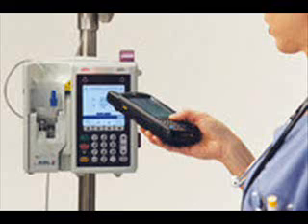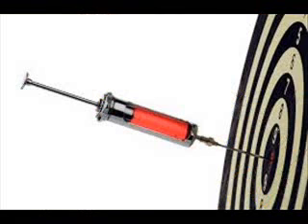Some common applications include pumping fluids in an infusion device, aggressive chemicals, and other materials where isolation of the product from the environment, and of the environment from the product, is critical. It is also used in heart-lung machines to circulate blood during bypass surgery, as the pump does not cause significant hemolysis. For this application and the importance of the infusion pump, it is relevant to mention the precision with which it must deliver the fluid, for the best control and to avoid medical complications.